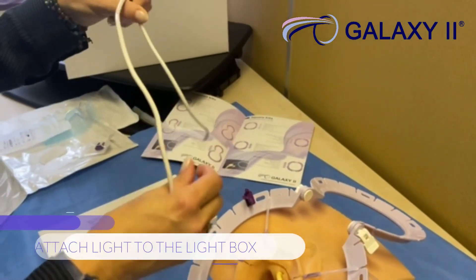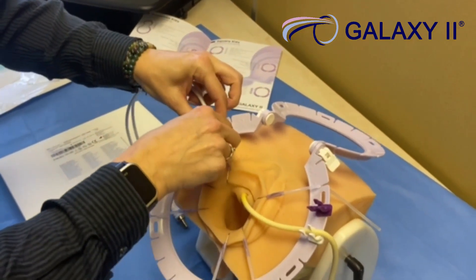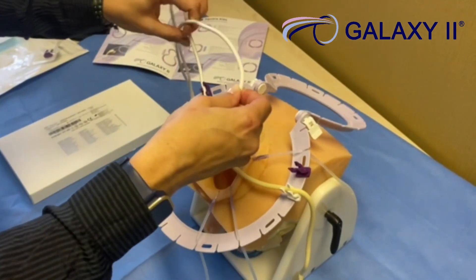The light will be attached to the light box. Each arm of the light slots into the light clips. The light can then be positioned as you wish.